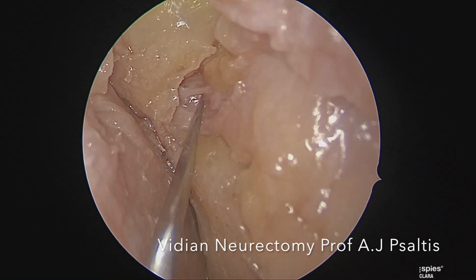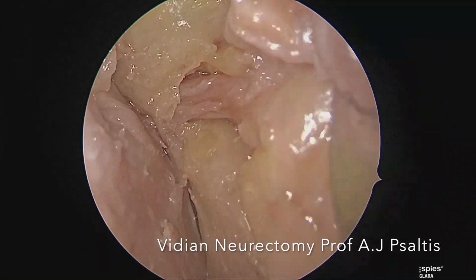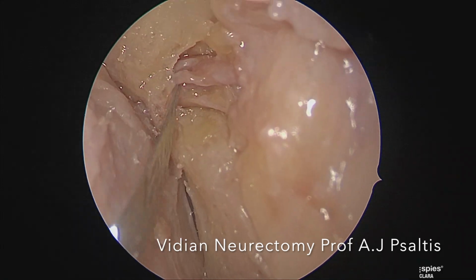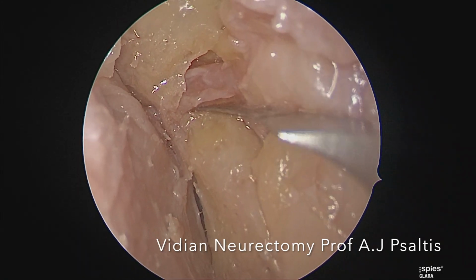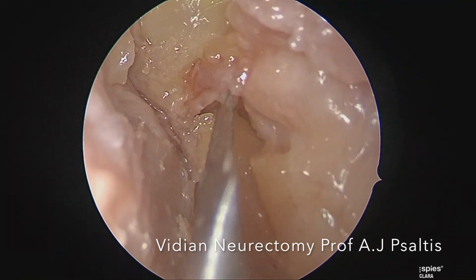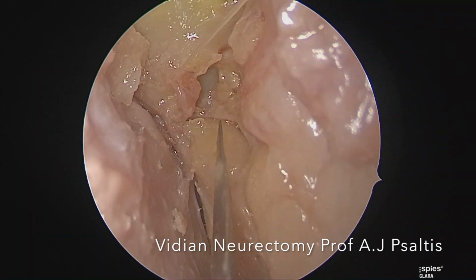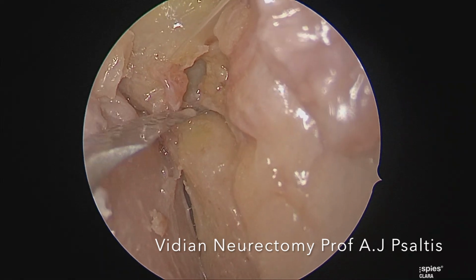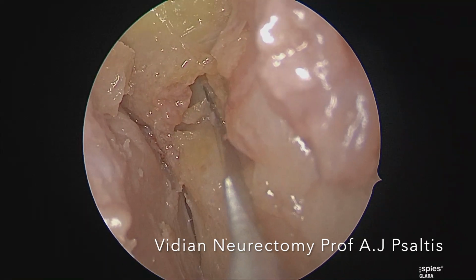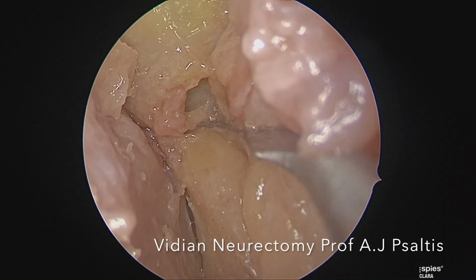And here we can see the posterior nasal nerve, which is a much smaller nerve compared to the Vidian nerve, running parallel with the palatine bone. This nerve needs to be sacrificed in order to gain access to the Vidian canal. Using a sharp sickle knife, the nerve is sacrificed, and this will allow us to gain access to the gutter in which the Vidian nerve runs.